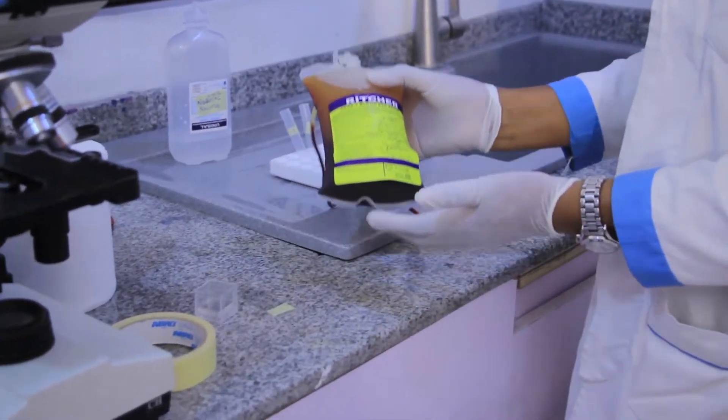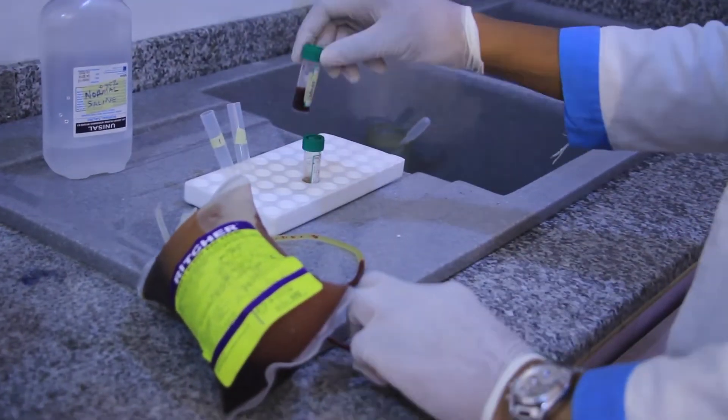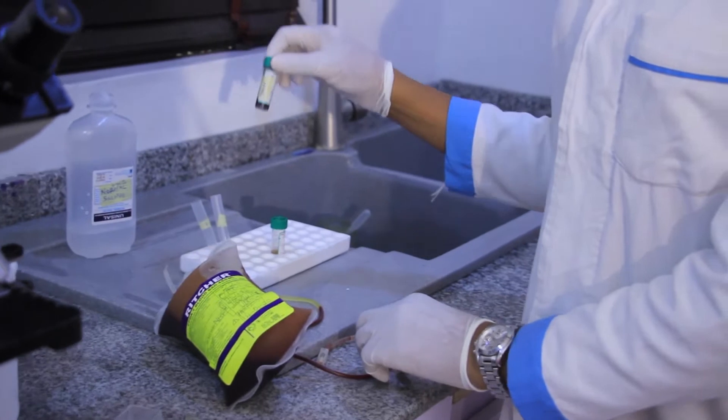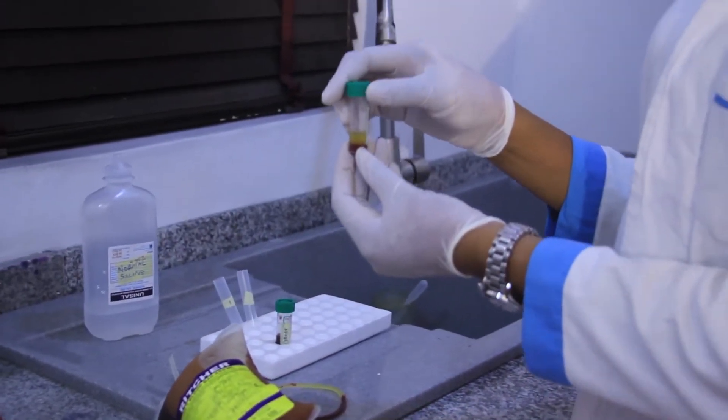Over here, this is the donor's blood sample. I have dispensed an aliquot inside this container. Over here, we have the recipient's plasma.